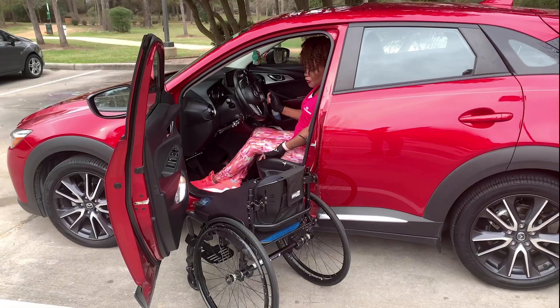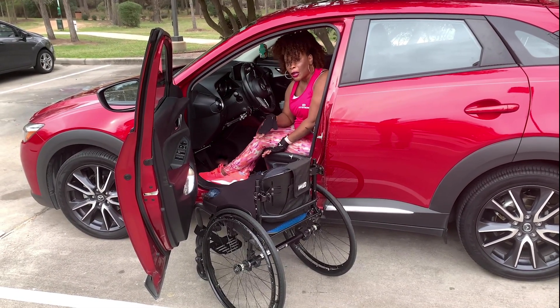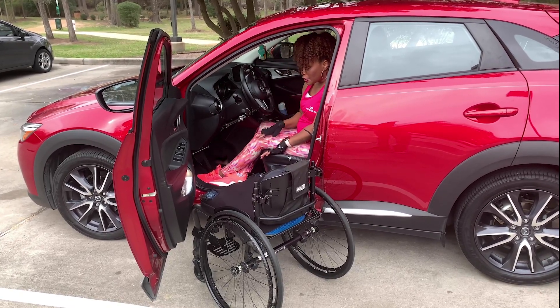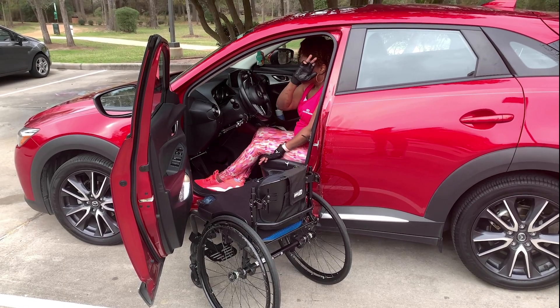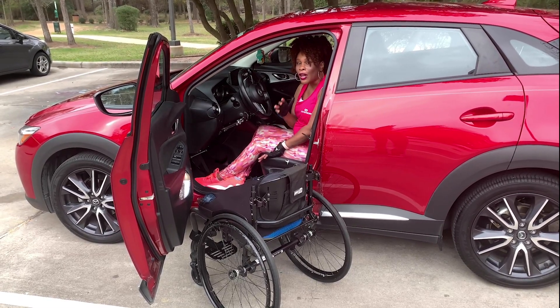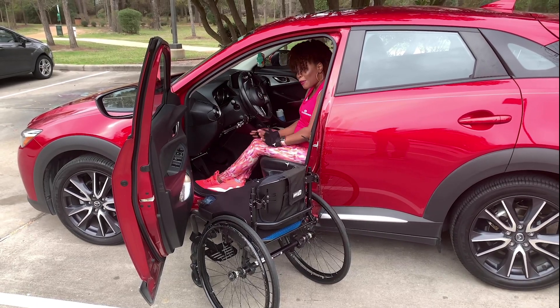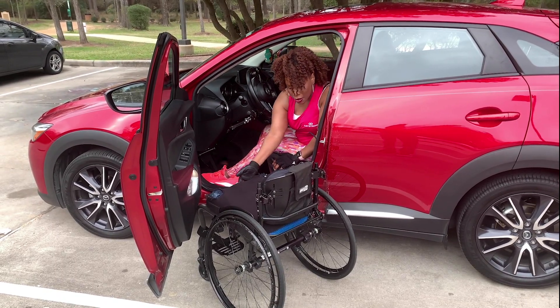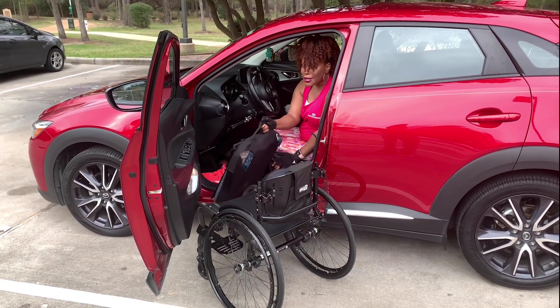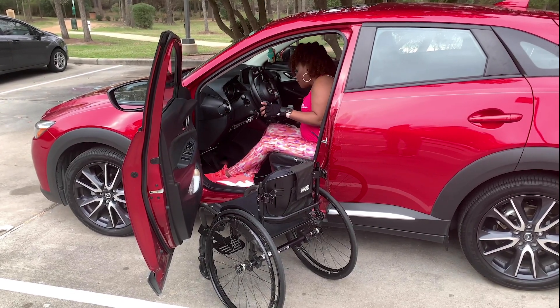Once you're in the car, it's important to make sure you have a good balance. That way when you start taking your chair apart, it makes it a lot easier for you to do things without literally falling back out of the car. The first thing I take off of my chair is my seat cushion. I put the seat cushion over on the passenger side on the floor.